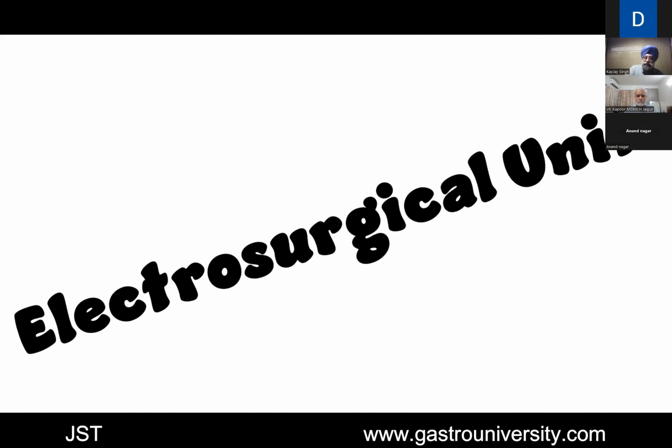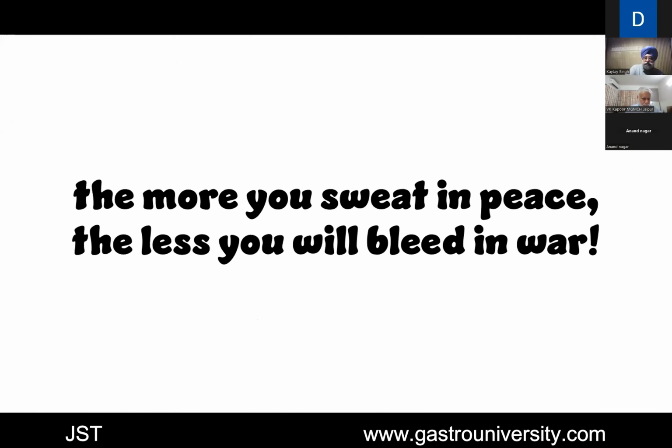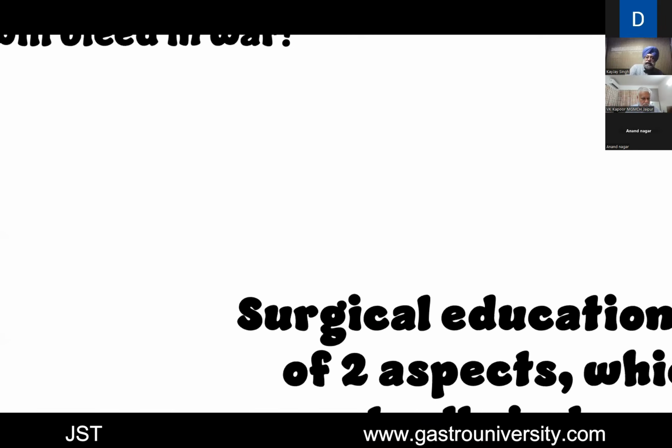So let's be very clear from here on. We should not be using the word cautery. We should be using electrosurgical unit or ESU. Now, the electrosurgical unit is a very dangerous weapon. And the more you sweat in peace, the less you will bleed in war.